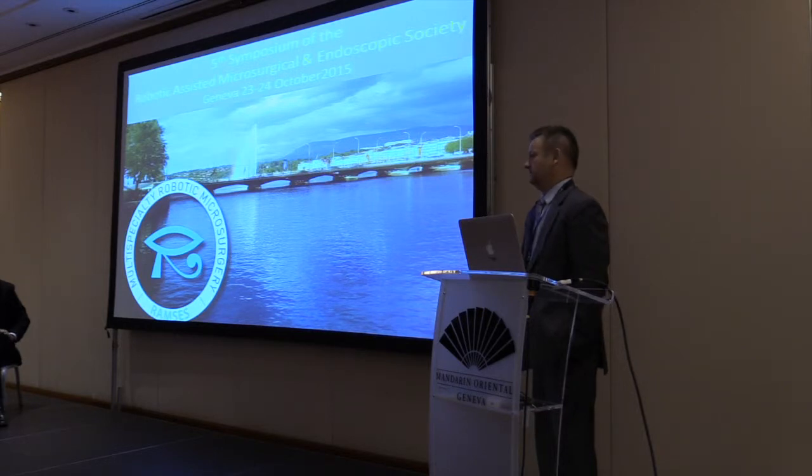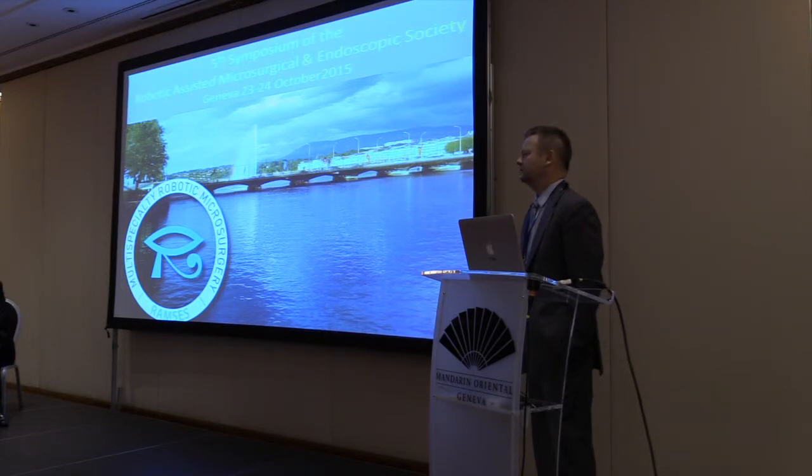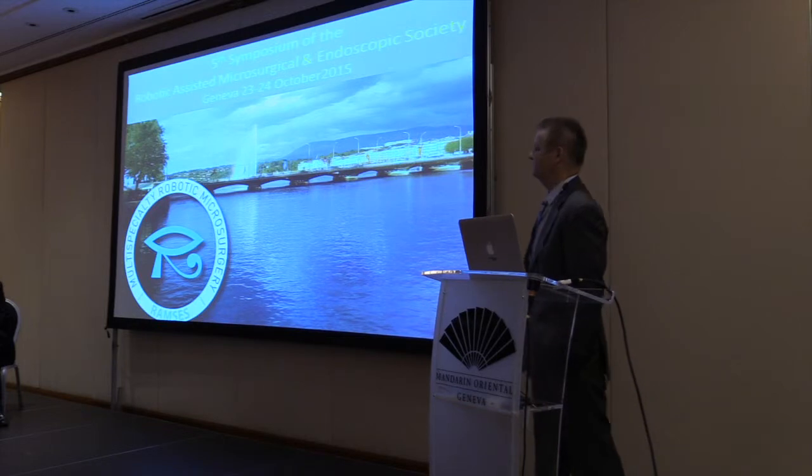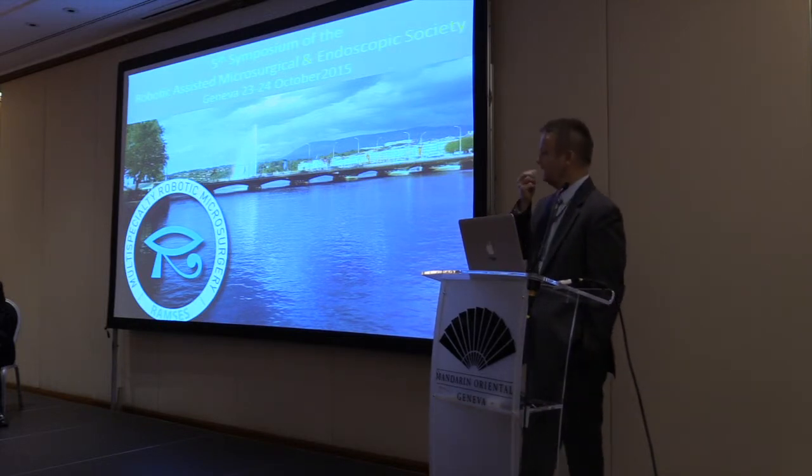The internal mammary case. It was a young patient, no comorbidities. Selective intubation, I suppose. Did you deflate one lung and just selective? Yeah, selective intubation. Yeah, of course. It must be selective. The selective intubation must be used. Yeah, it is similar. If you perform transabdominal, it's necessary to selectively intubate.